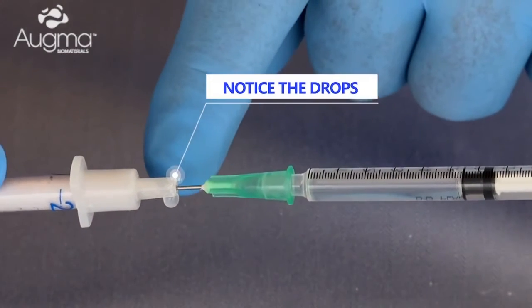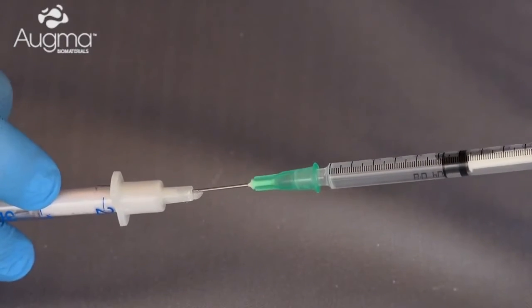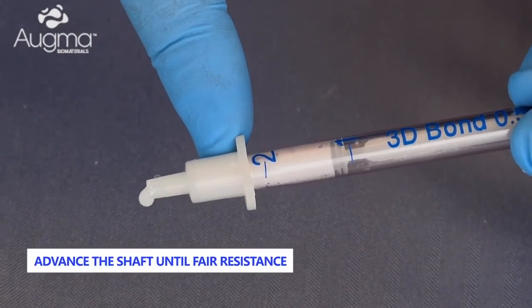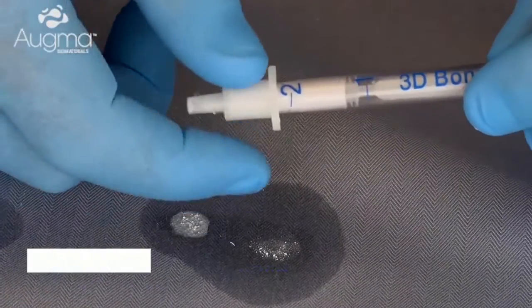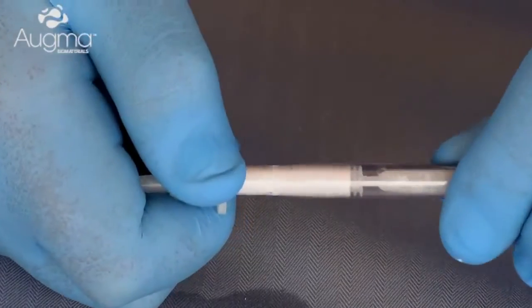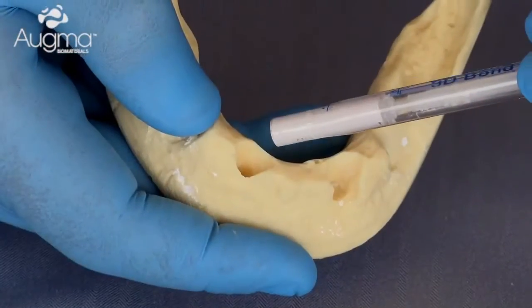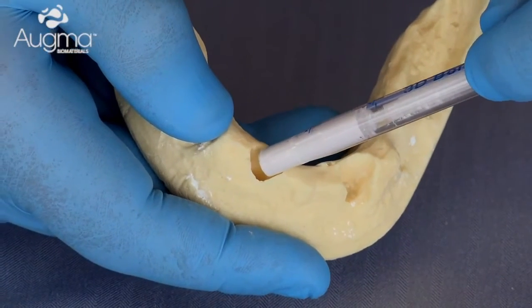Then we detach the needle from the 3D-Bond driver. In order to expel liquid surplus, we start advancing the shaft forward until fair resistance is noticed. We then remove the 3D-Bond driver head, and we are ready to eject the material into the socket site.